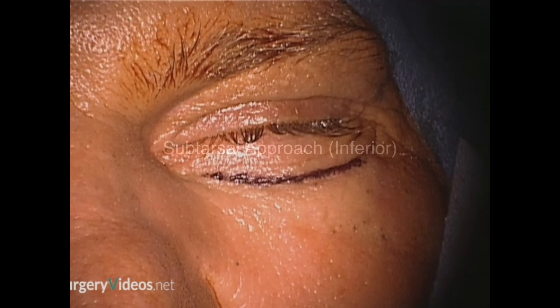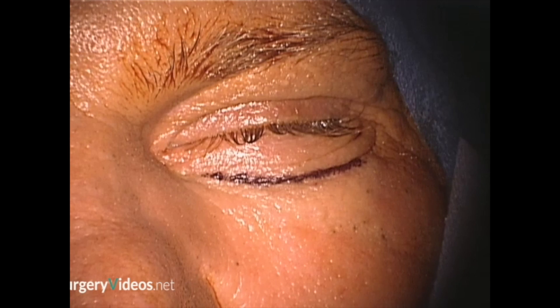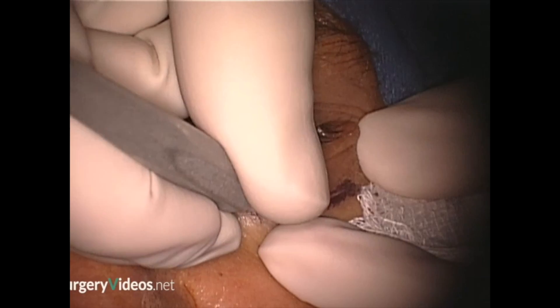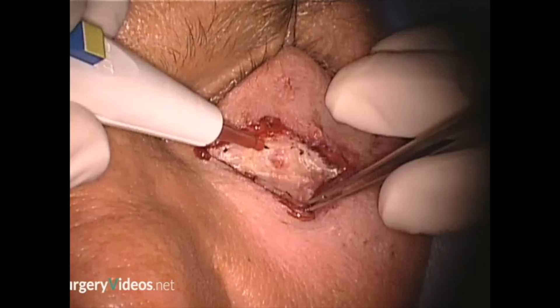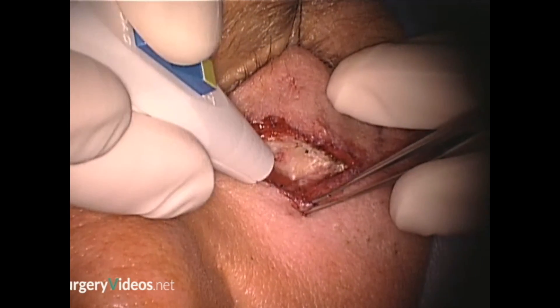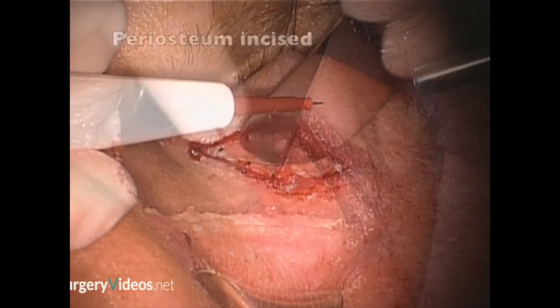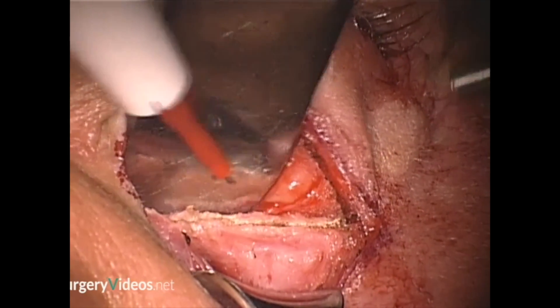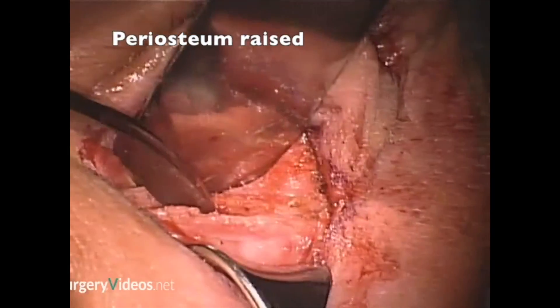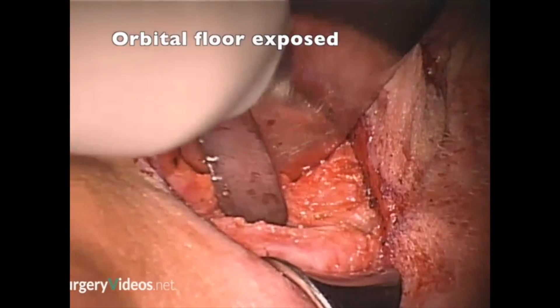The subtarsal approach is an effective and straightforward method of accessing the inferior orbit. The skin has been marked and an incision is made along the lower border of the inferior tarsal plate. Dissection then continues through orbicularis along the direction of its fibres, progressing through the preseptal plane toward the orbital rim. Once periosteum is reached, it is then incised just below the orbital rim using monopolar cautery on a cutting setting. The periosteum is then gently elevated to expose the orbital floor.